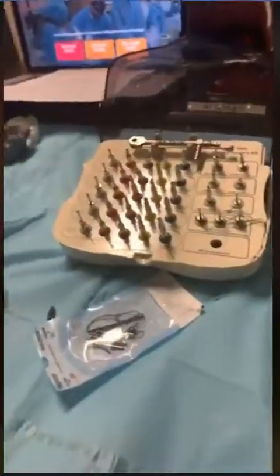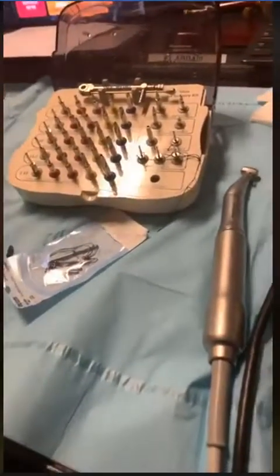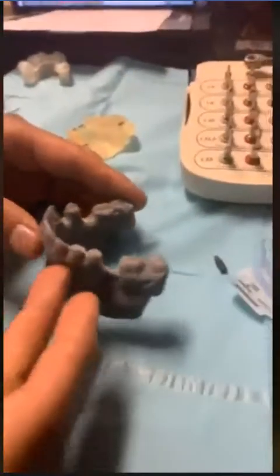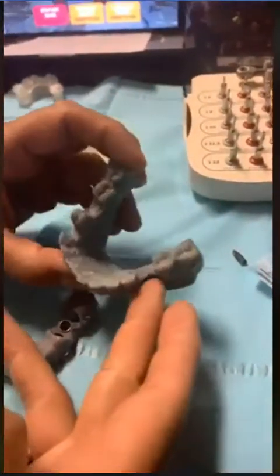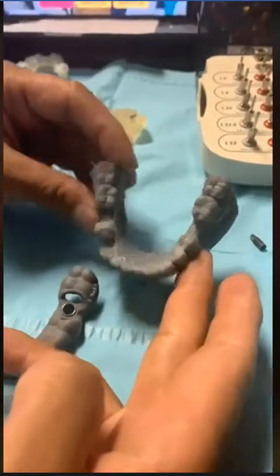Now that we discussed that, let's go ahead and show a case that we are going to do, and we'll do one surgery. So here is a patient. I basically have taken the patient's jaw model, and we have printed out the patient's jaw model here.